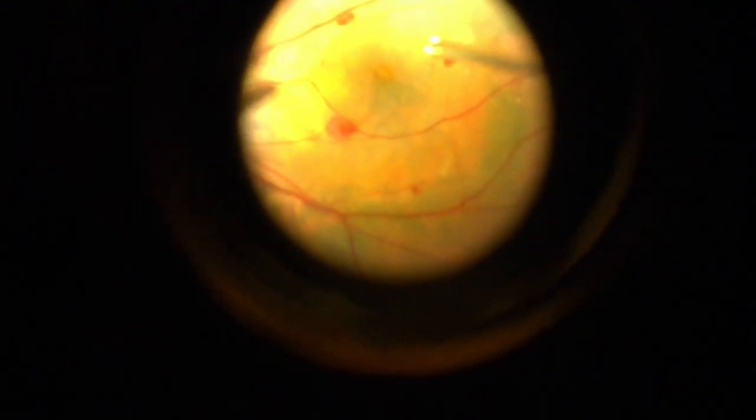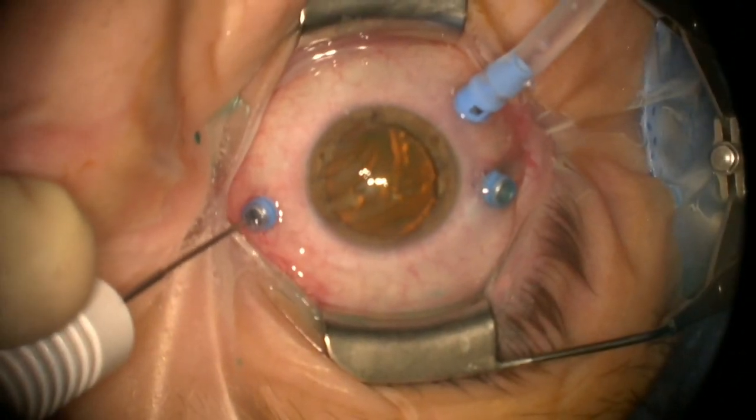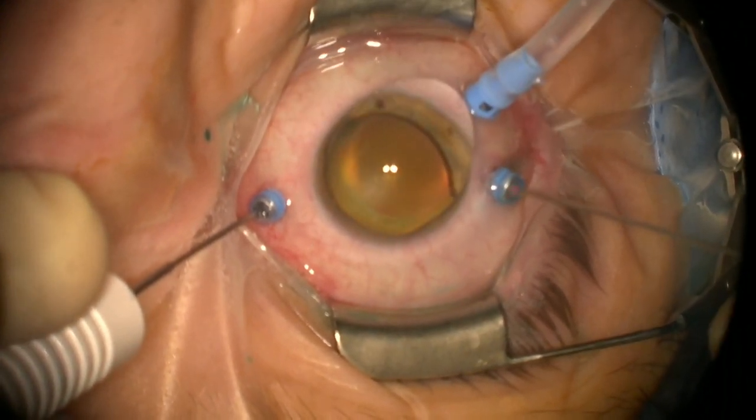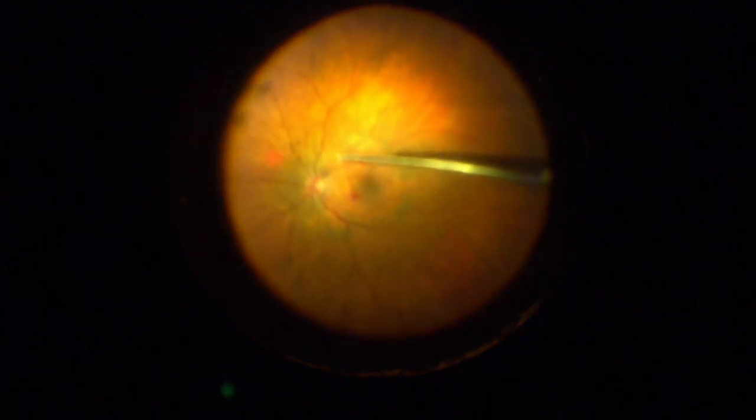And this is going to put her a long way towards probably getting better treatment for the diabetic macular edema off the Eylea injections. Right, I'm going to put the PRP in, and then we're going to look around with the depressor. So we're going to put some light PRP in. Again, she's a moderate diabetic patient, moderate on the angiograms that were done pre-op, which I didn't bring photos of for you. And so, you could certainly argue to skip this and keep her on injections and so on. I think that's just a tremendous burden for the patient to be injected for diabetic retinopathy.